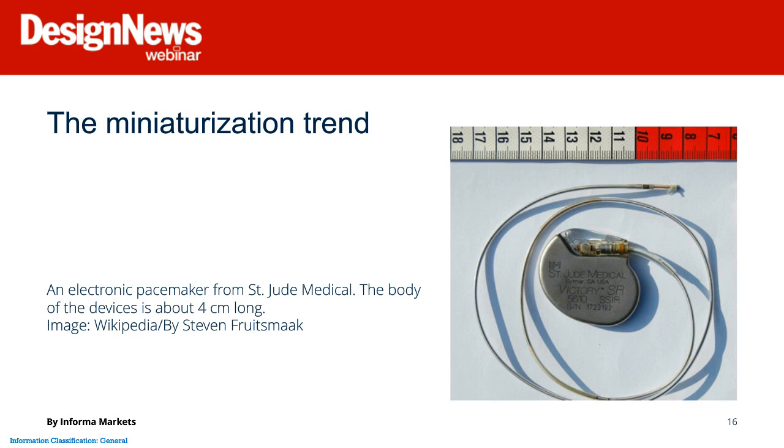So here you have the modern-day pacemaker. This is a far cry from the tabletop units of the early 1950s that we saw earlier. The evolution from AC-based tabletop units to battery-powered systems actually occurred pretty quickly. Earl Bakken, an electrical engineer who was part of a two-person company called Medtronic, Inc., was asked by physicians at the University Hospital in Minnesota to design a battery backup for their AC-based pacemaker system back in 1957, and the first recipient of this was in 1958.